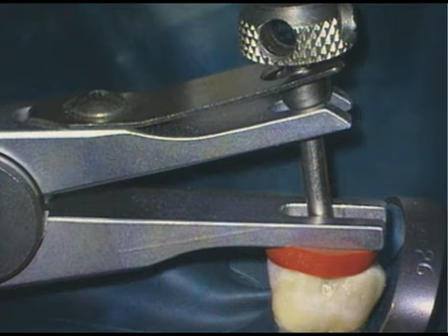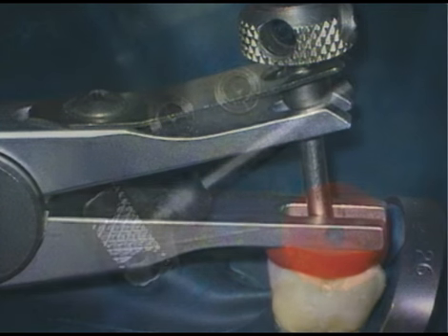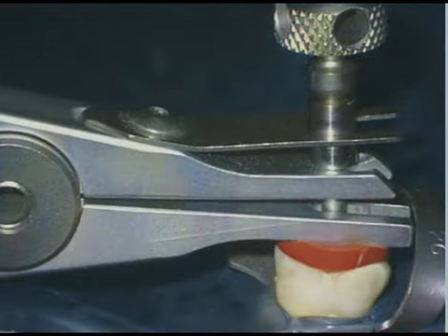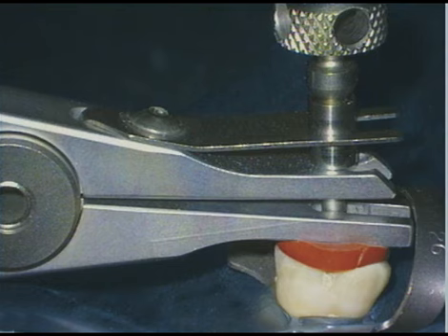Let me make a suggestion when the arms of the extracting plier are too far apart. In these instances, we're pulling the post undesirably off axis. To better direct the removal load forces on axis, we can use thin metal spacer tubes. These spacer tubes can be inserted onto the tap to bring the arms of the extracting plier closer together and better align the removal loads.